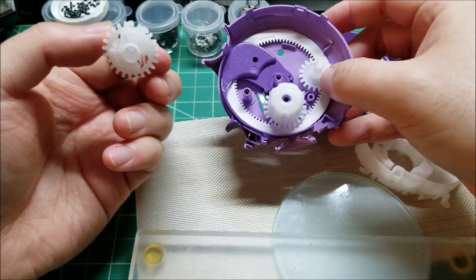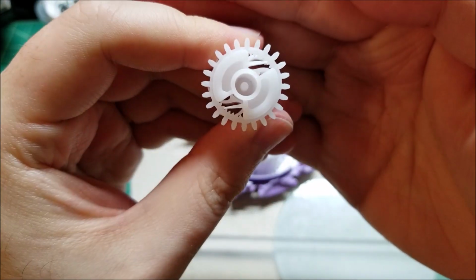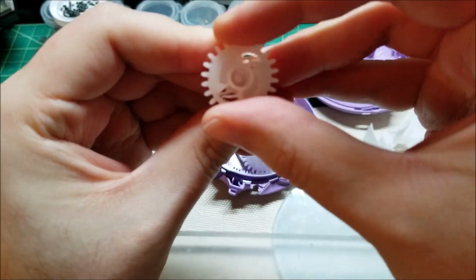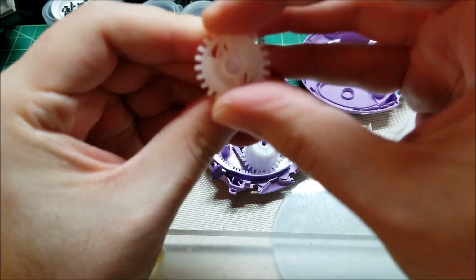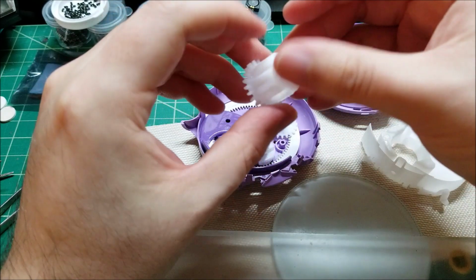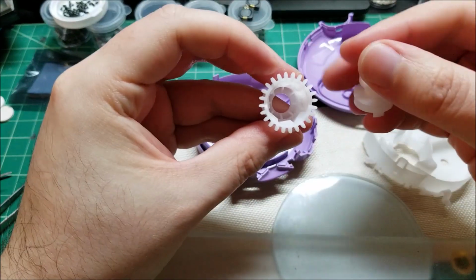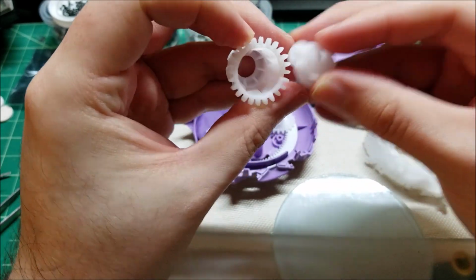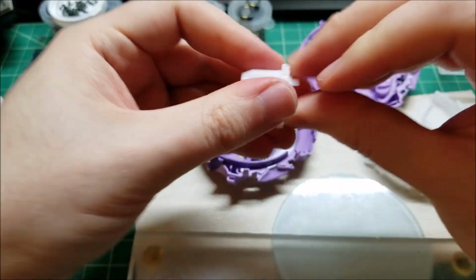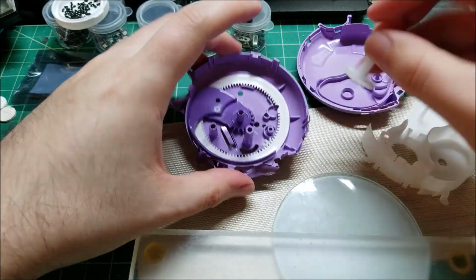So we're just gonna start taking out some of the gears. And you can see, oh, that's interesting. There's little fingers in there so that you can only rotate. This is like a one-way slip mechanism. So it ratchets like that. This is just a regular kind of gear, but there is a serration on the inside, and I believe that's to do the same thing. The teeth are on this inner hub. Yep, so it'll do the exact same thing. So everything is ratcheted to only go in one direction.